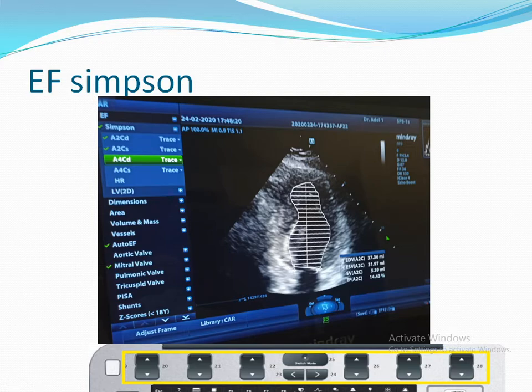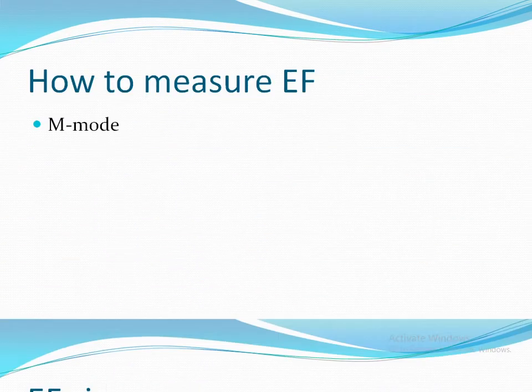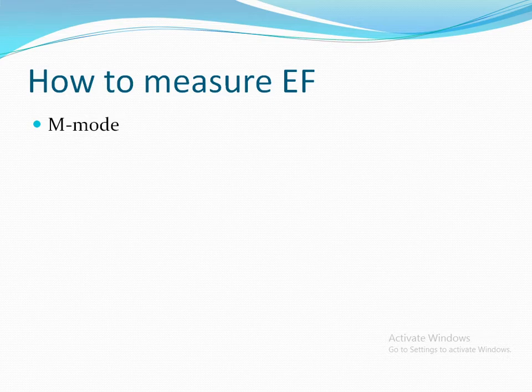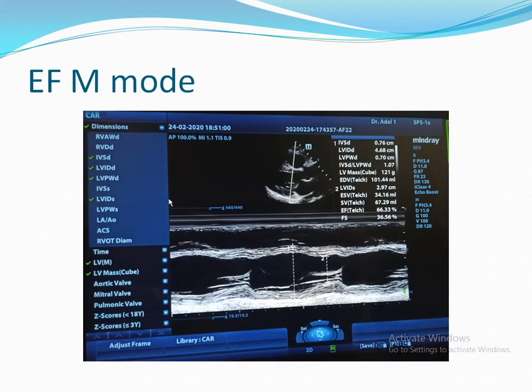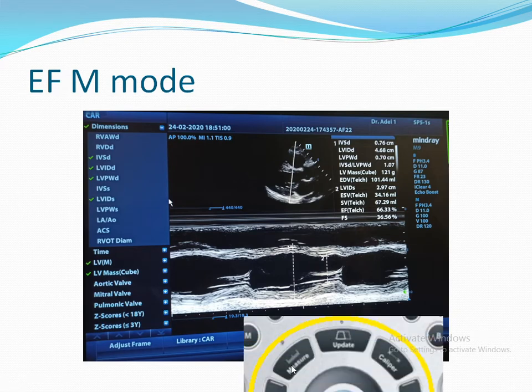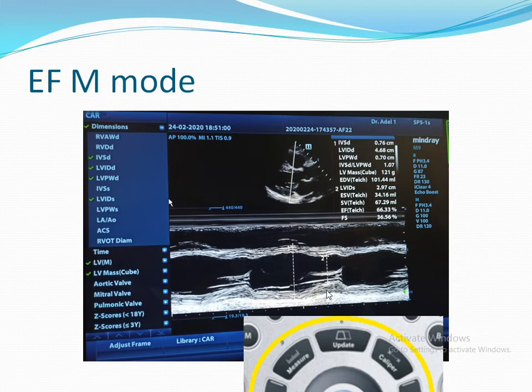How to measure Ejection Fraction by M-mode: after you obtain your M-mode image, press Measure. We will start from the interventricular septum in diastole — measure the septum, then measure the posterior wall. After that, choose the systolic frame and measure the septum and posterior wall in systole as well.